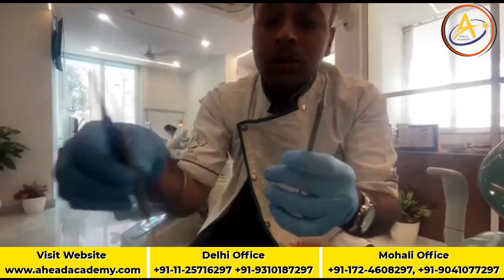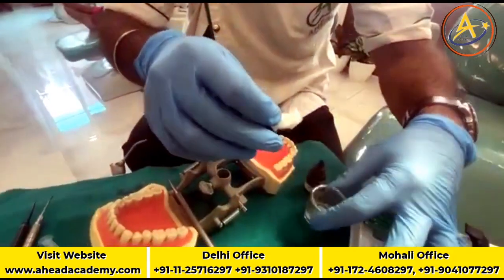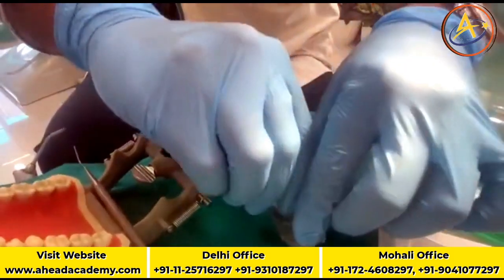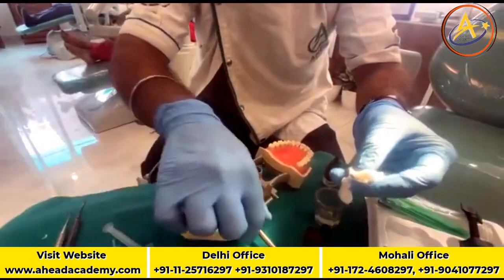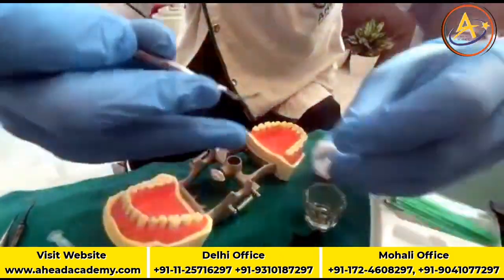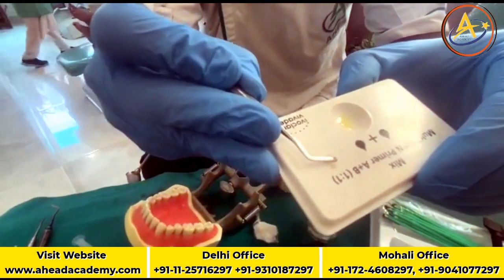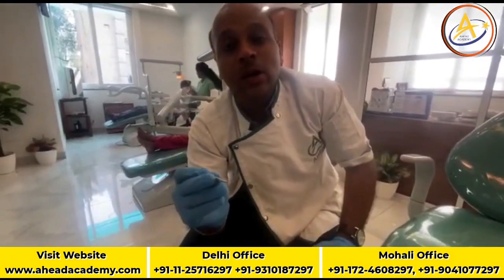So how to clean the surface of the instrument? Just take a dry cotton, dip it in spirit. In this vial, there's spirit, alcohol, and remove the extra alcohol. Just see. You are going to use this cotton for cleaning of the instrument surface. Now squeeze the instrument surface with this cotton, and now you find your instrument is very neat and clean. Now see, composite is not sticking. Just see, it's not sticking. So remember, it's the cleanliness of the instrument which is responsible for not sticking of composite.